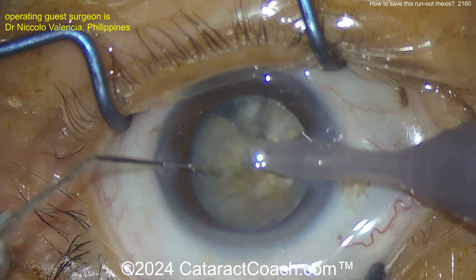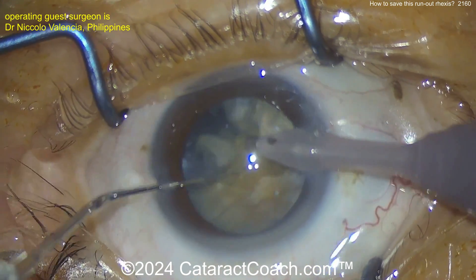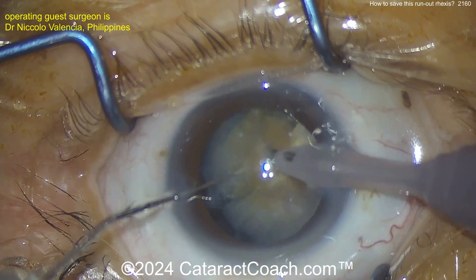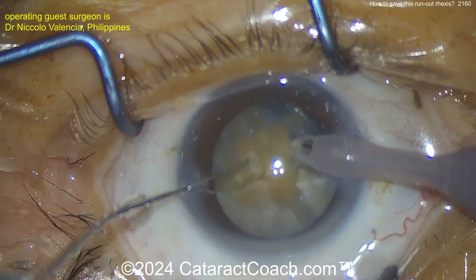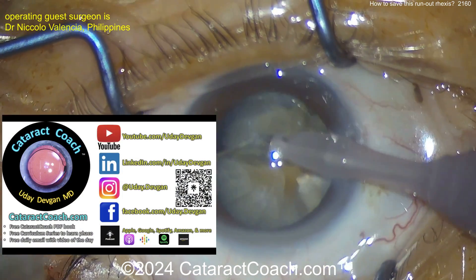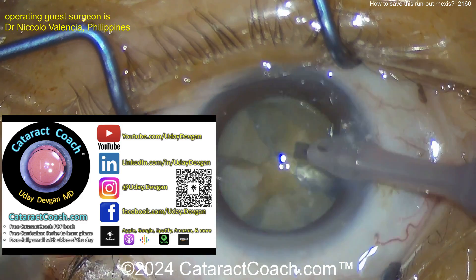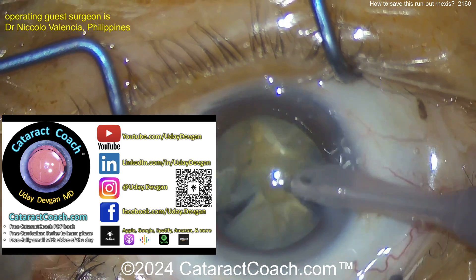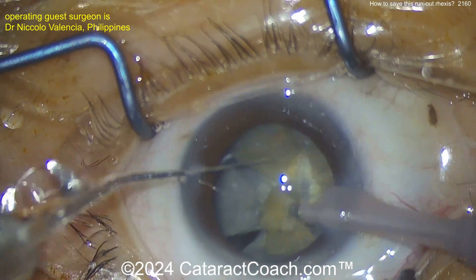This is a little denser cataract than we expected, so it can have some attachments at the posterior aspect of the lens. Just take your time. I like the technique of bringing the pieces up and not working too much in the capsular bag — chop the pieces, then bring them up one by one. Go to CataractCoach.com — there's a whole section on white cataracts and the Argentinian flag sign. That's what I would have recommended here: the double rhexis technique.